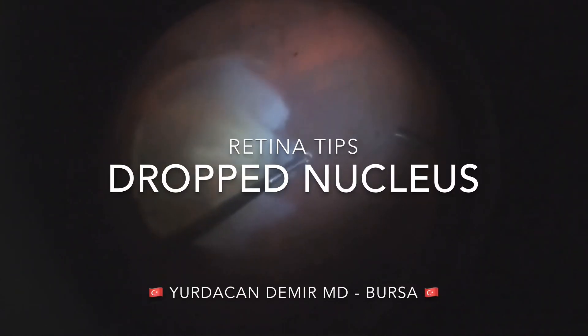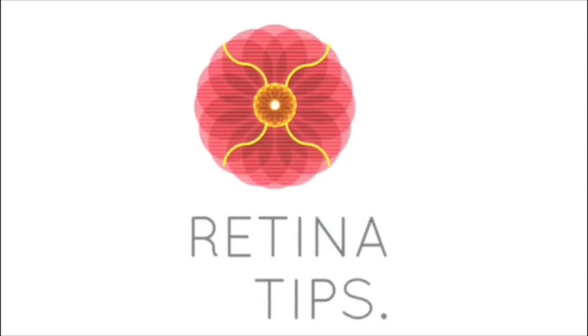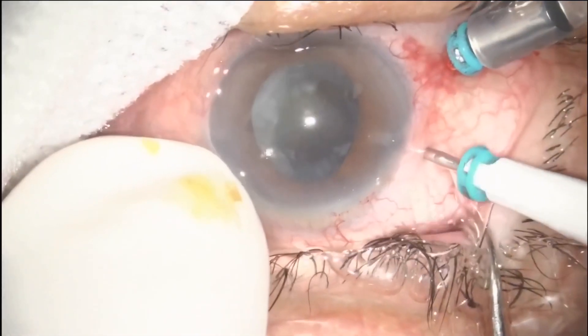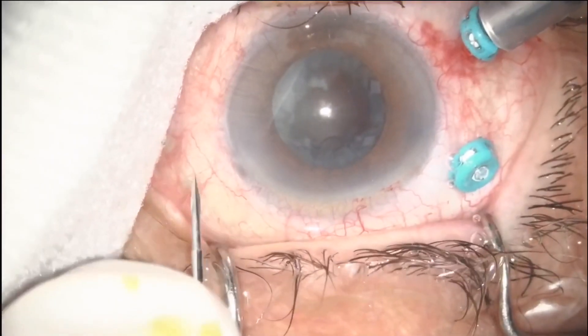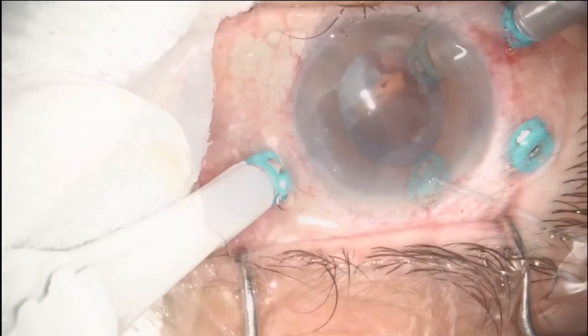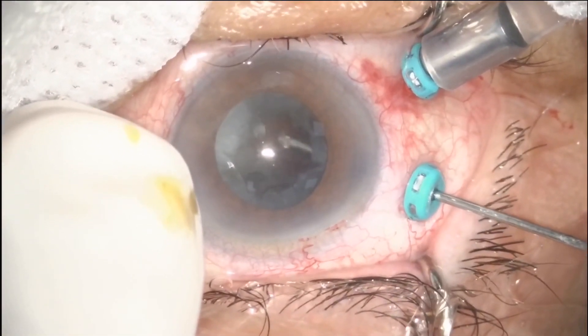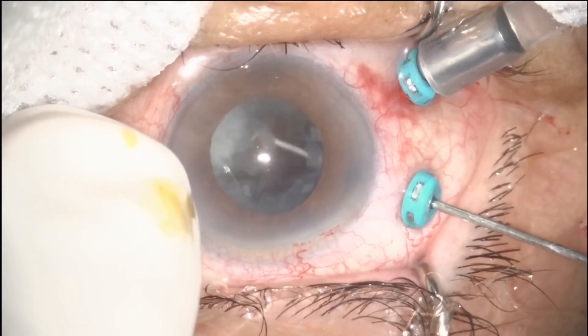This is the case of a dropped nucleus, shared by Dr. Yurdacan Demir from Bursa, Turkey. In this video, we discuss a technique to approach a dropped nucleus using perfluorocarbon liquid to bring it to the anterior chamber and to remove it with phacoemulsification. The first step is to remove the vitreous core and vitreous membranes in the pupil and anterior chamber.